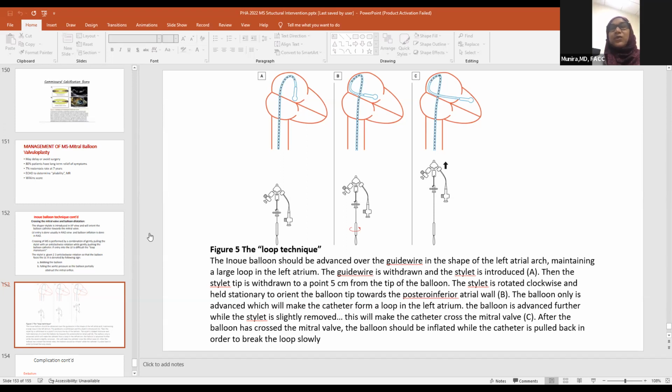So it was an excellent discussion, actually. The intervention part, even though I'm not an interventional cardiologist or cardiac surgeon, I really learned a lot about that. Especially, the dextrocardia with valvuloplasty case was amazing. I have to admit, I never knew that a mirror image can be done with that fluoro, and this is the way to do it.